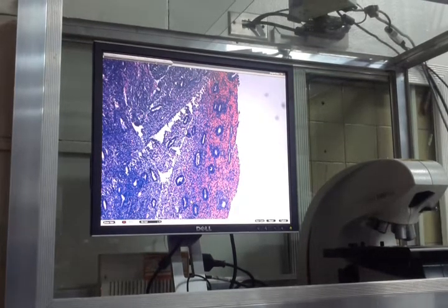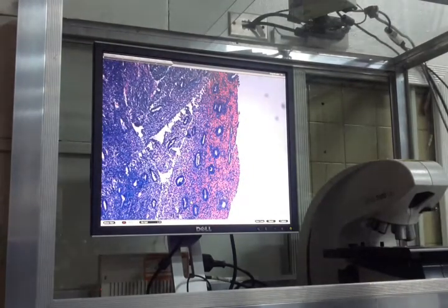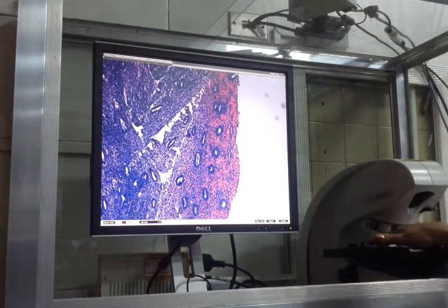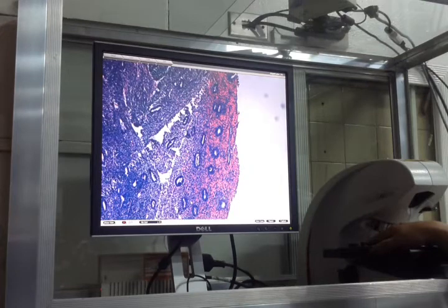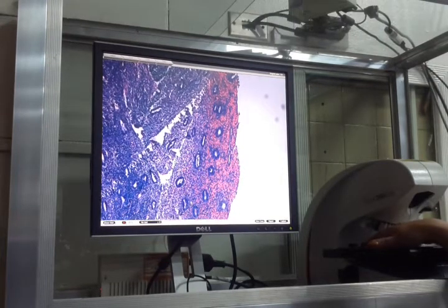Regular yung mga endometrial glands, same sizes, and they form straight lines towards heaven. That's the proliferative endometrium. You just saw the Swiss cheese appearance. If you see the Swiss cheese appearance, that's endometrial hyperplasia. And then 12.